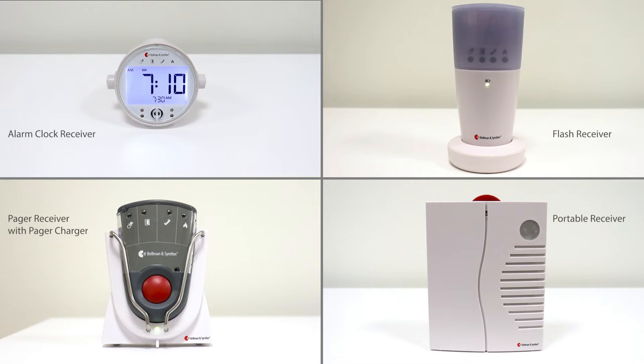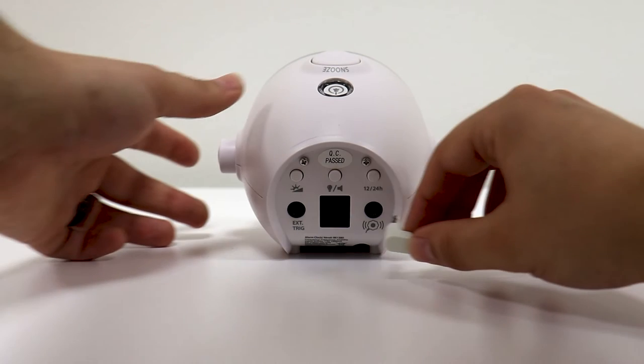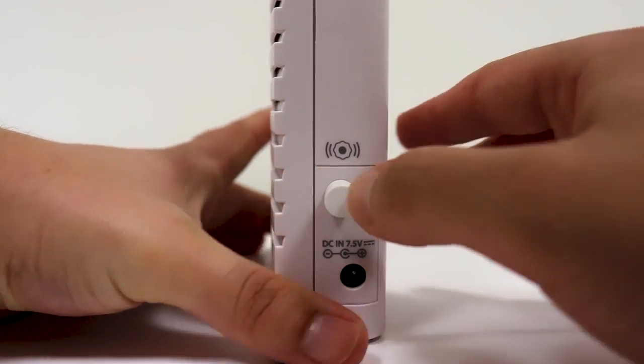To get started, we will show where to connect the Bed Shaker. The receivers have a 3.5 millimeter jack where you can plug in the Bed Shaker — plugging into the alarm clock receiver, plugging into the flash receiver, plugging into the portable receiver, and plugging into the pager charger.